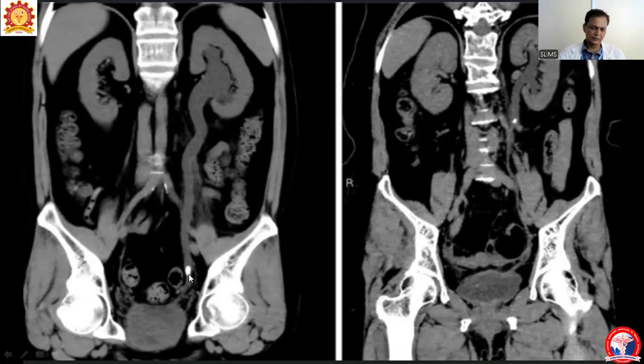Distally, in the lower ureter, maybe 5-6 centimeters proximal to the ureterovesical junction, there is an obstructing oval calculus, which is causing complete obstruction. So the proximal ureteric dilatation, hydroureteronephrosis. On the second image, we are seeing a different patient.